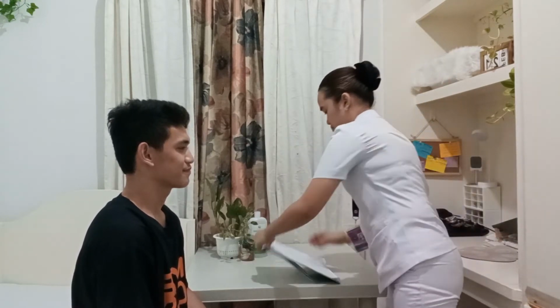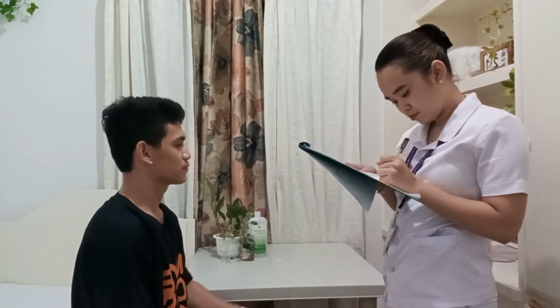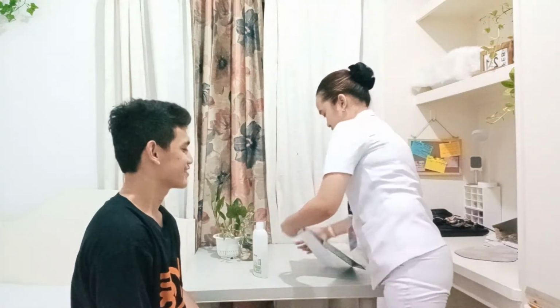Now I'm going to document the pulse rate of my patient to his TPR sheet. Now I'm going to perform hand hygiene for disinfection. Okay, thank you, Mr. Patrick, for your cooperation, and have a nice day. Thank you so much.